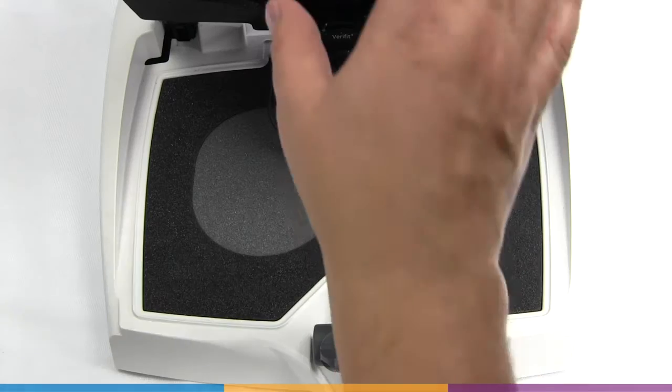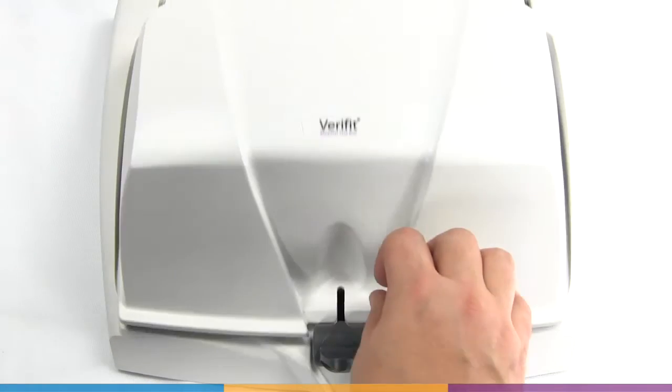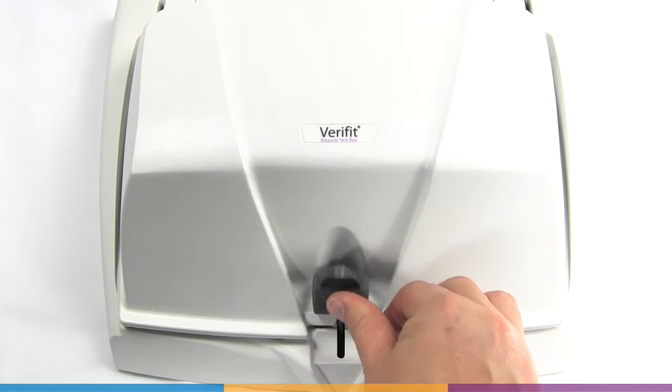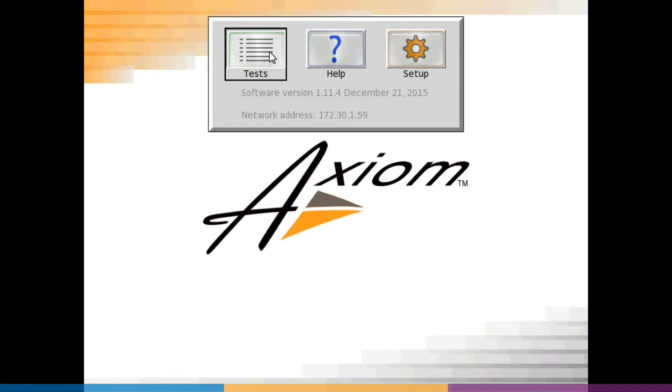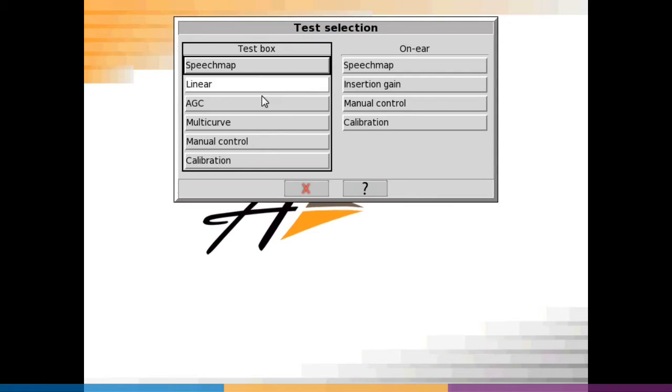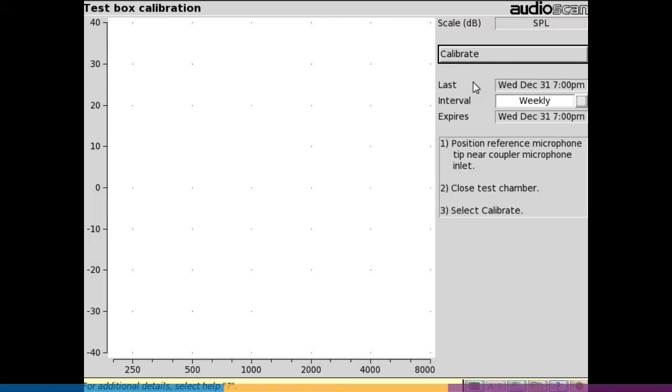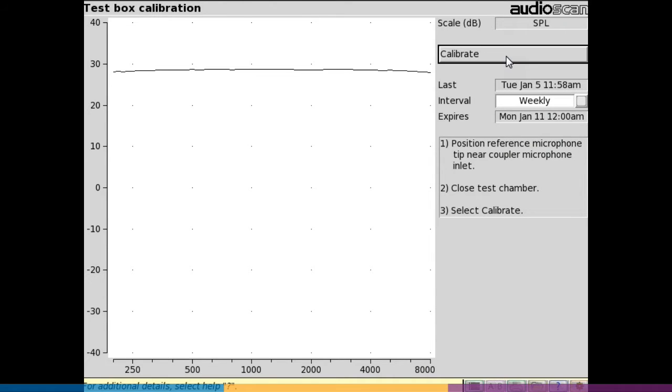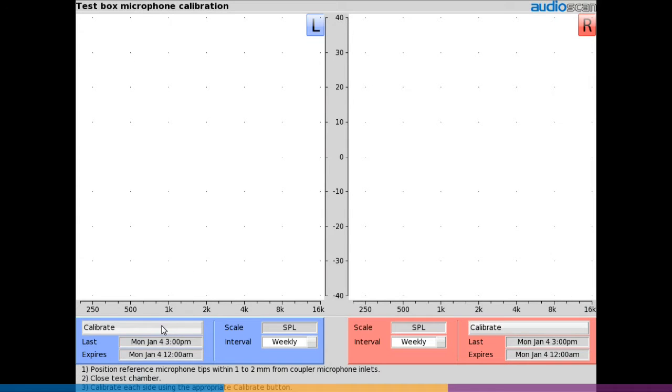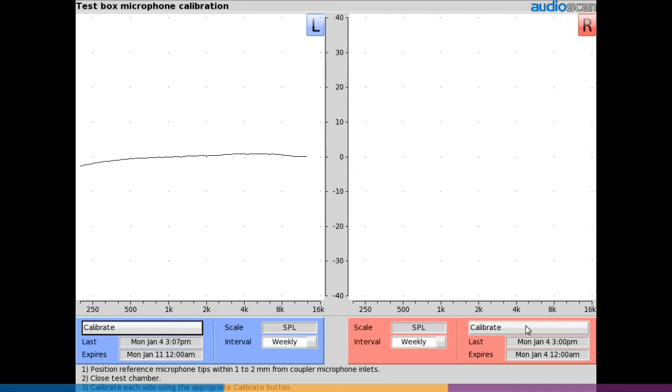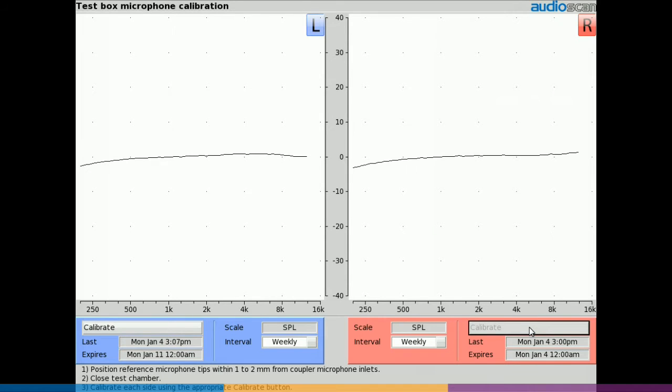Once positioned, close the TestBox lid. For all models, from the Tests menu, choose TestBox and Calibration. Click the Calibrate button. On Verifit 2, you will need to select the Calibrate button for each side of the binaural coupler microphone.